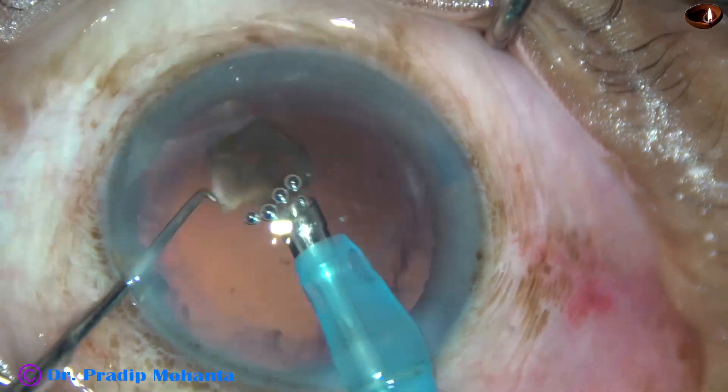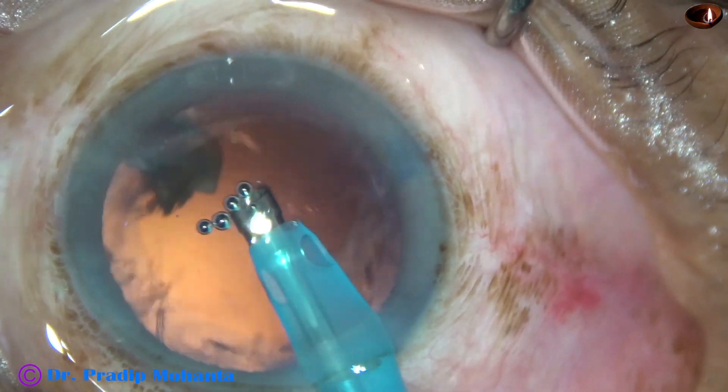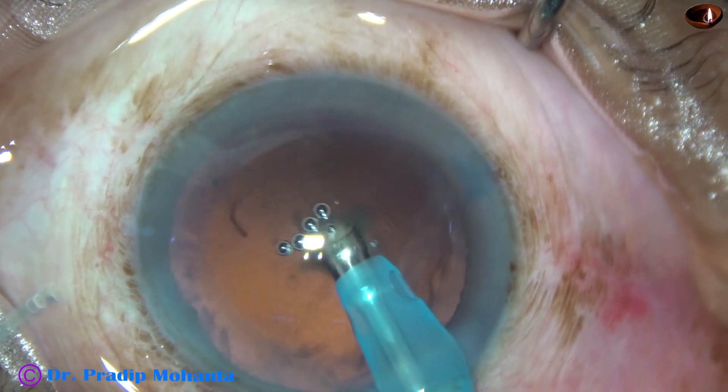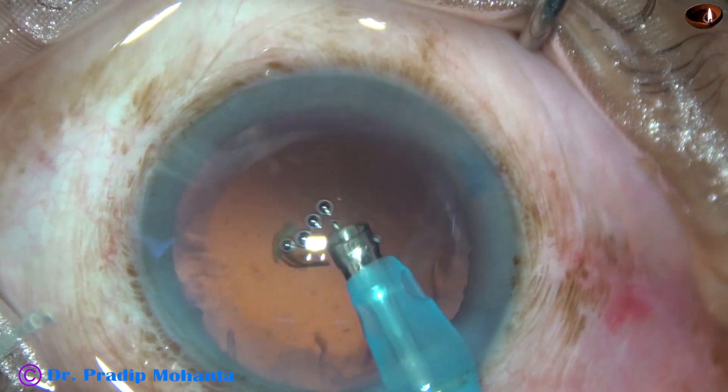This is the last portion of the last piece. At this time I switch to vacu-on mode where the vacuum is only 80 mm of mercury. And thus the nucleus management is completed.